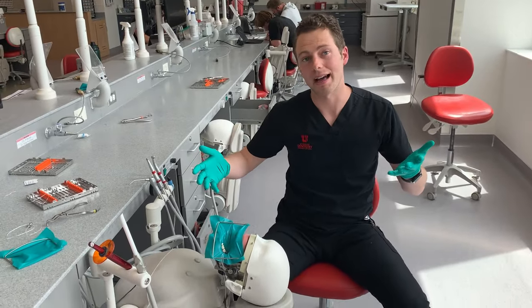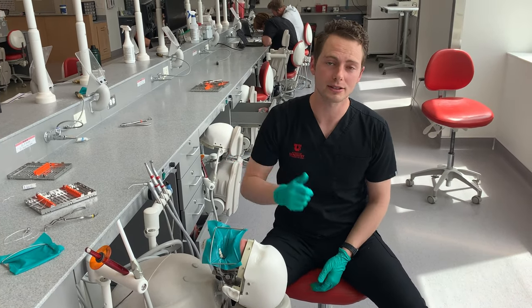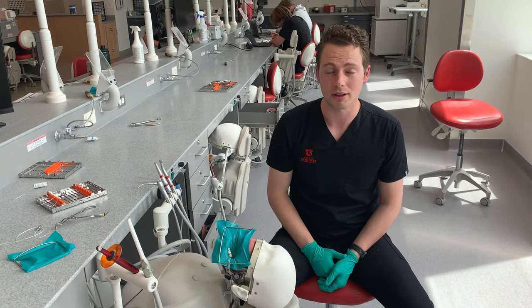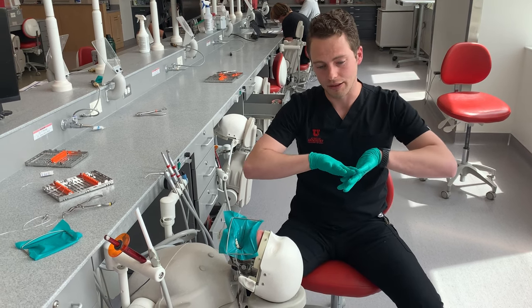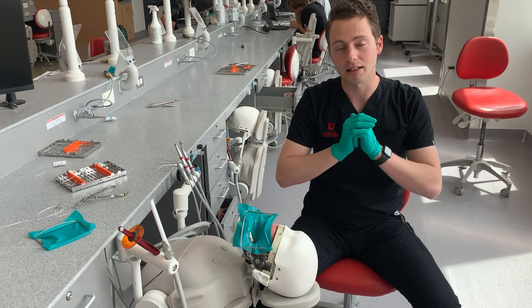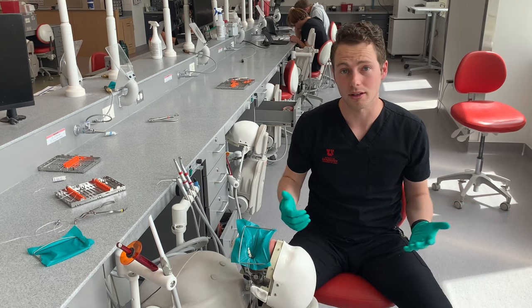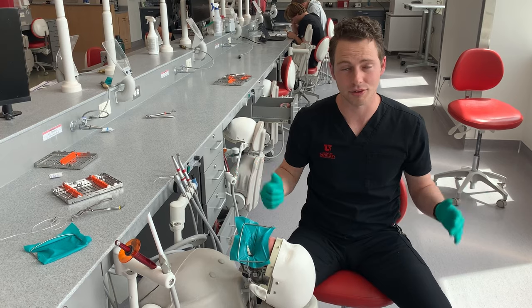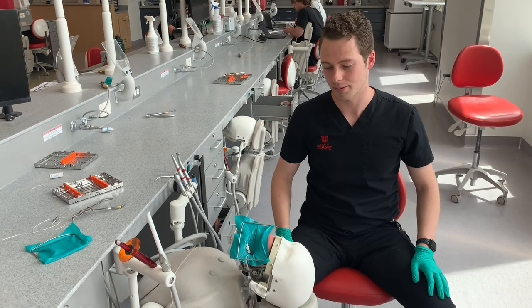I'm passionate about showing people how to do it quickly because I feel like if you are looking for ways to place the rubber dam instead of situations not to place it, then you're more likely to place it. Using a rubber dam reflects the tissues, it reflects the cheeks, it creates a clear operating field in which you're going to produce higher quality work. So getting good at placing it quickly is important so that you're using it as frequently as you possibly can. I hope these ways help, and good luck.